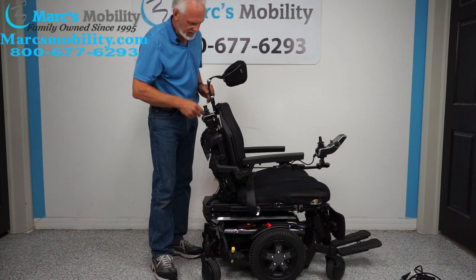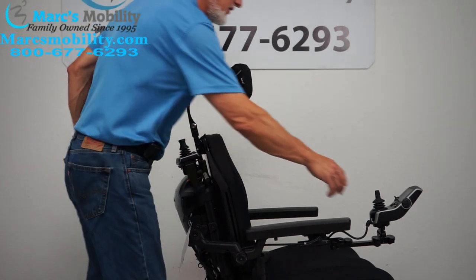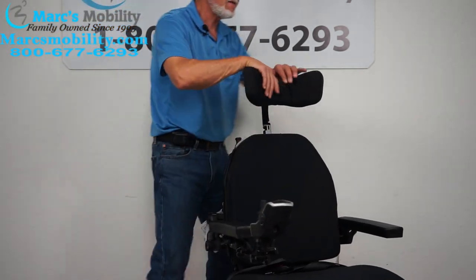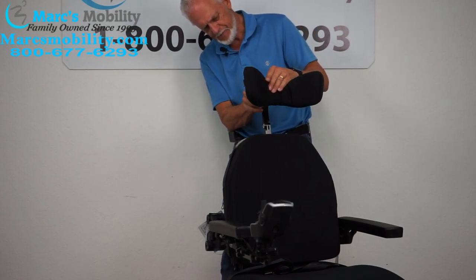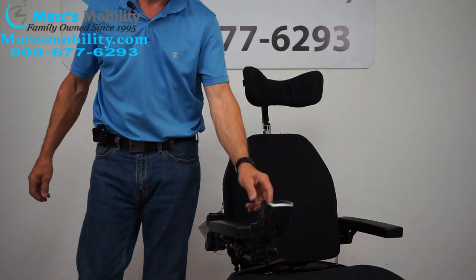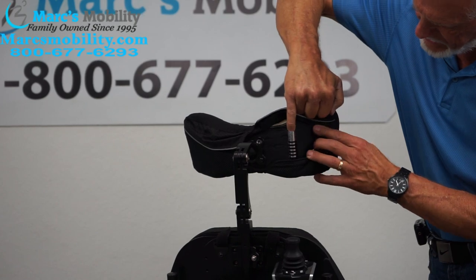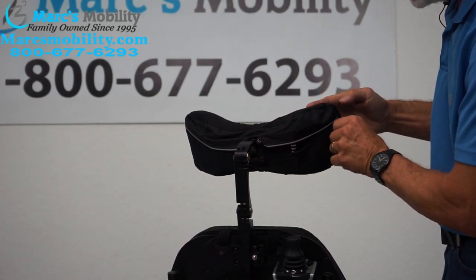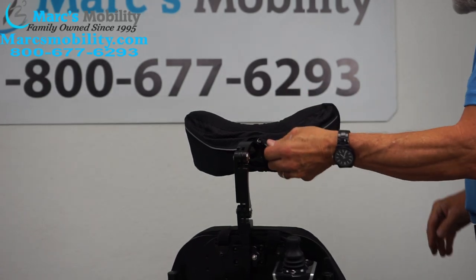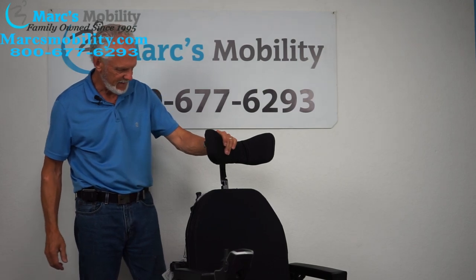This chair also has a custom headrest. These side wings can be brought almost against your ears. There's a hinge on both sides — you put your Allen wrench in here and you can adjust it wide open, wide shut, anything you want. This is a custom headrest for people who have trouble keeping their head on the headrest. Right now it's about half open, but you can bring it in much closer.